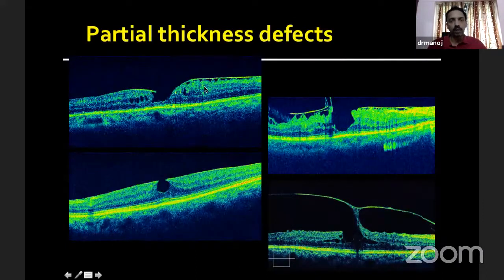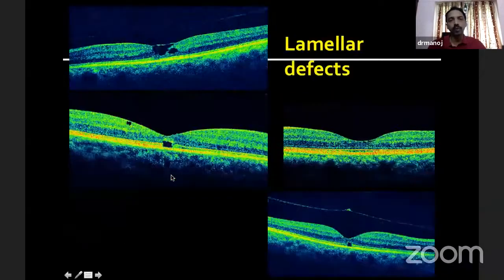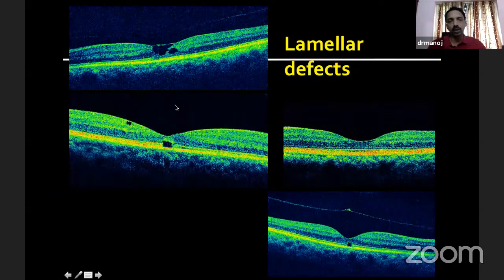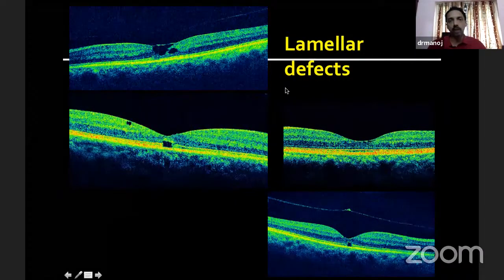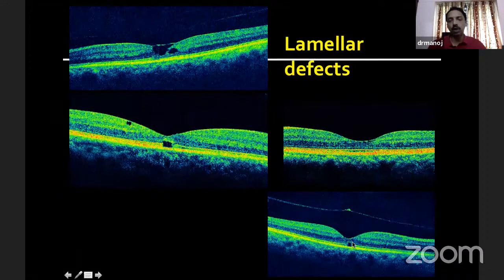Then you look for partial defects like these — examples of partial retinal thickness defects. Here you can see the associated pathology: a vitreomacular traction causing a partial lamellar hole, and this is an epiretinal membrane with a pseudo-hole. You can also see defects within the retinal substance without any traction outside — these are called lamellar defects, typically seen in patients like macular telangiectasia, where you see small defects in the inner or outer layers. This is a condition called micro-hole, where there is a focal area of loss at the photoreceptor layer.